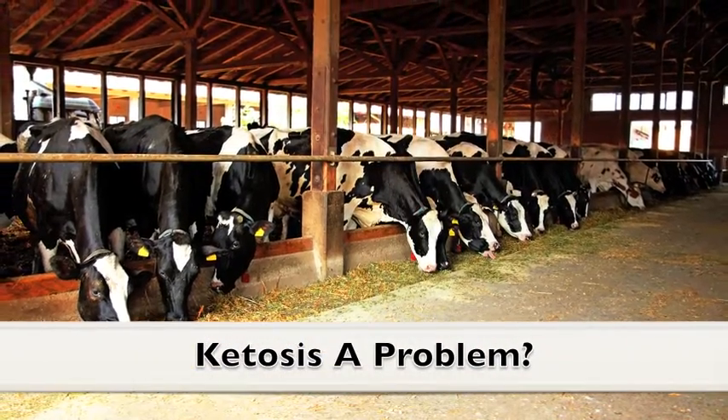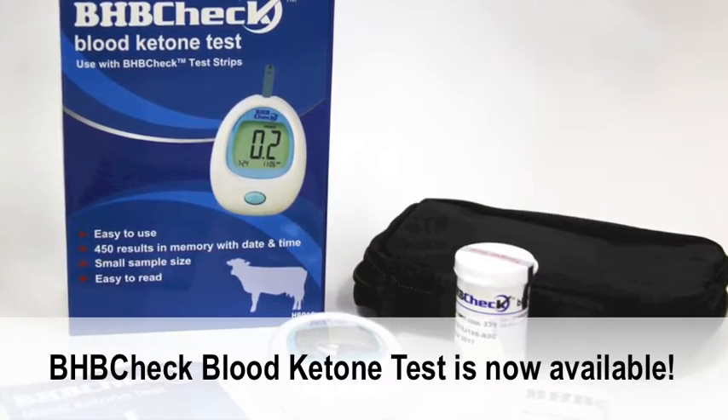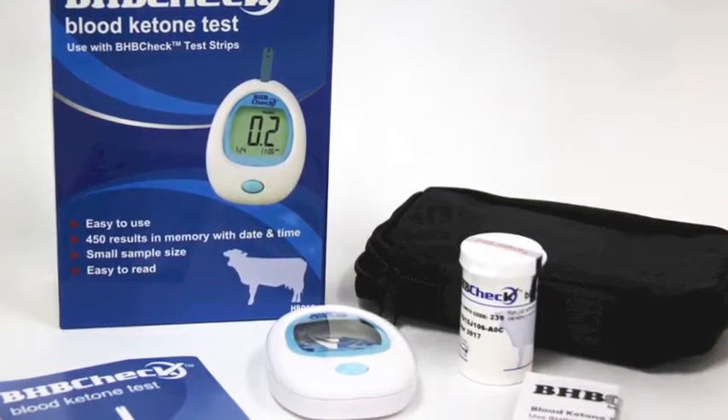Is ketosis a problem? Portacek has introduced the BHB Check blood ketone test to help dairy producers monitor for ketosis.